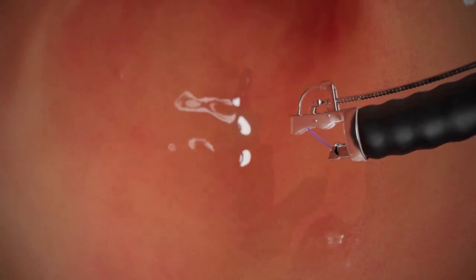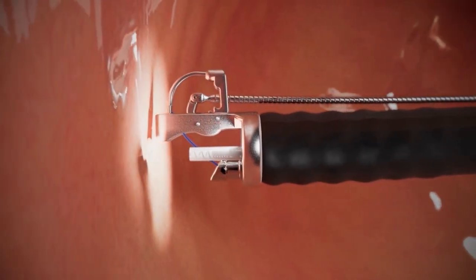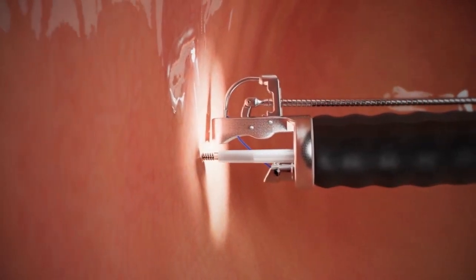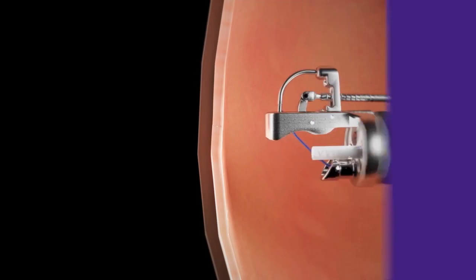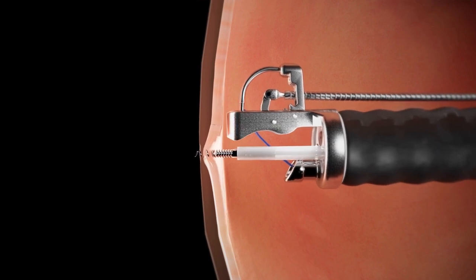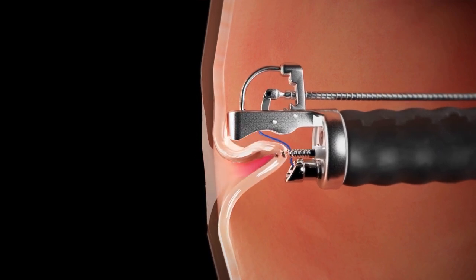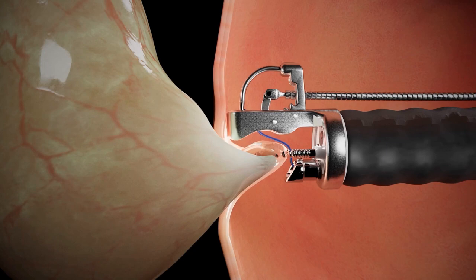The endoscopic sleeve gastroplasty, when performed with an over-the-scope suturing system, uses a tissue helix via the accessory endoscope channel to acquire gastric tissue. The tissue helix provides efficient capture of the gastric wall, assisting with full-thickness suturing. However, it has known disadvantages. Foremost, the operator may inadvertently overdrive the helix in a transmural fashion, leading to potential perforation, penetration through sensitive structures like the peritoneum, or capture of extragastric structures such as the omentum, spleen, or gallbladder. In most instances, these events are not readily identified and can lead to delayed complications.